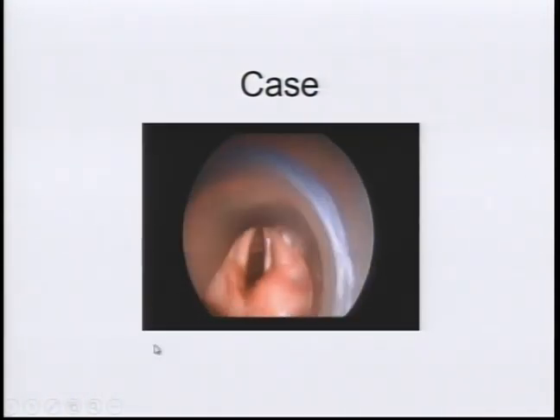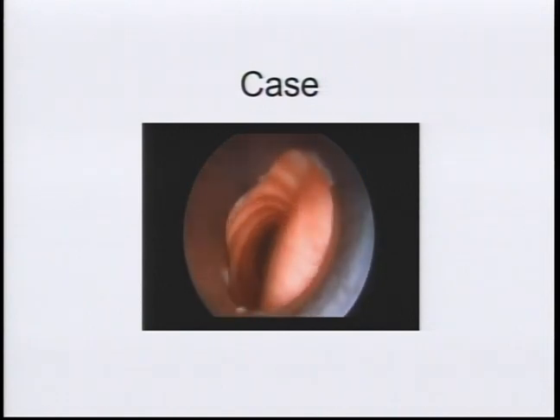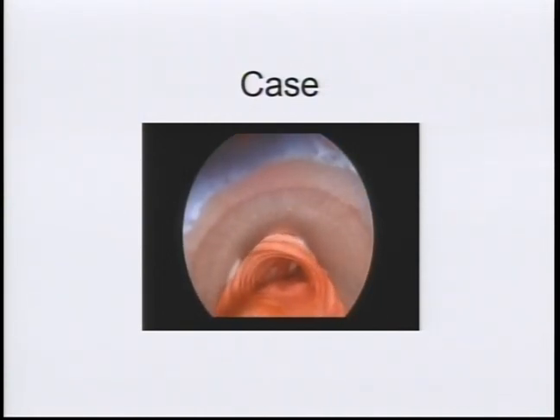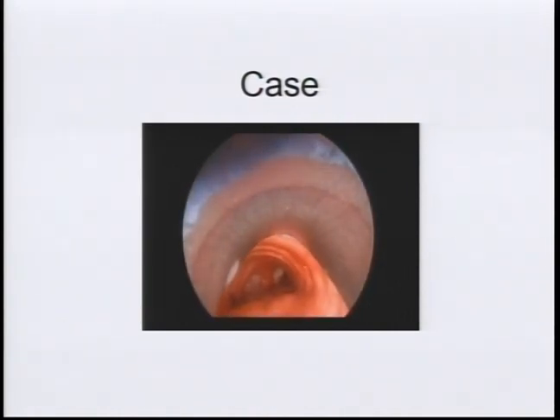This was her bronchoscopy. So this is a rigid, is it playing? Yeah, it's a rigid bronchoscope. And most of the time you use rigid bronchoscopy when you need to deal with this type of problem, a central airway obstruction that's causing significant symptoms and at risk for respiratory failure and massive hemoptysis.